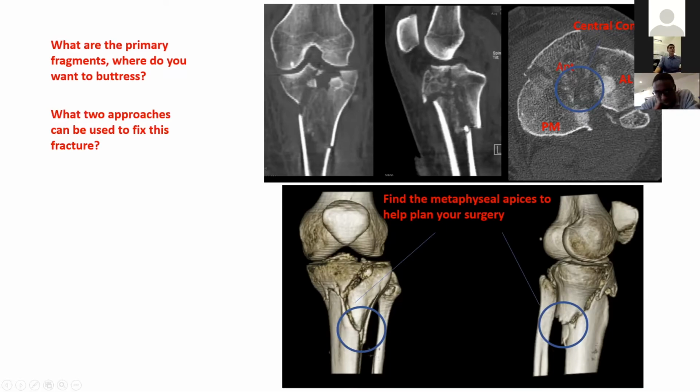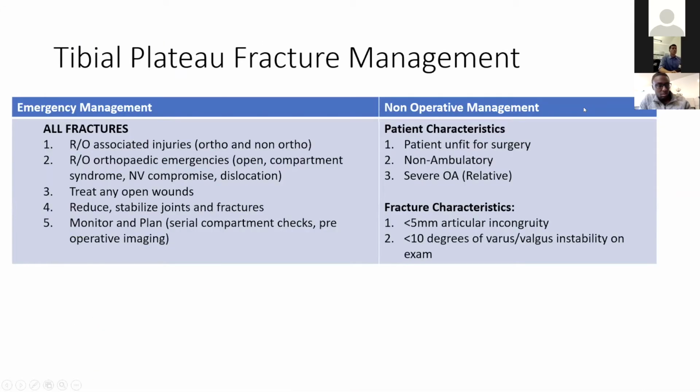How to access this anterior bit is controversial. I mean, you're going to get 100 answers if you ask a bunch of surgeons how to do this, but I do like your plan, elevate a flap, because you can make your posteromedial approach, it's a very mobile window. And if you made it more medial, you're going to have no problem getting a plate posteriorly and getting some fixation into that anterior fragment. So I'd probably keep my posterior medial approach a little bit more anterior because I know that I'll still be able to get a plate here and give me a little bit of view into this fragment here. But yeah, that's 100% what I would do.